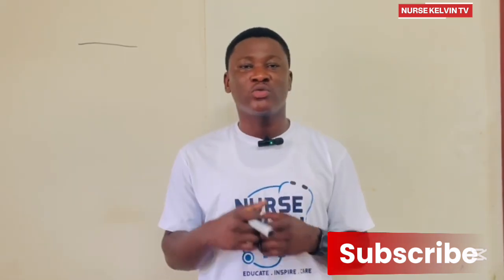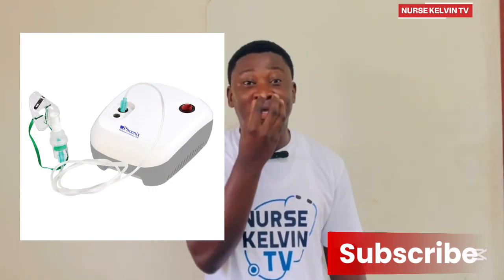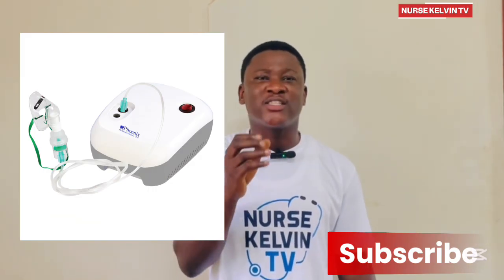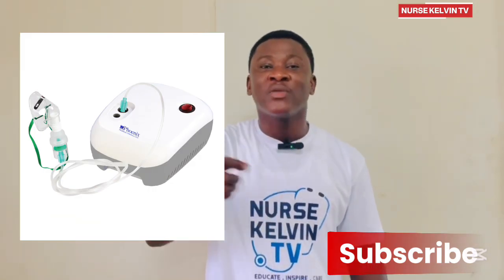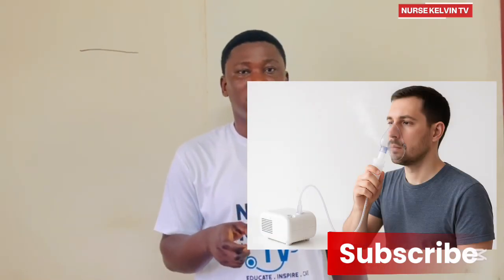Then the next one that we are going to talk about is the nebulizer. When you talk of the nebulizer, this device is going to turn a fluid medication into a mist for inhalation. So what does it do? It turns a fluid medication into a mist for inhalation.